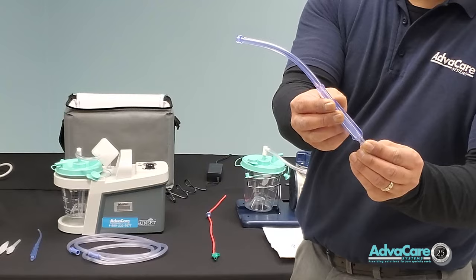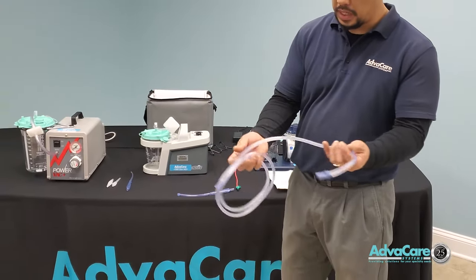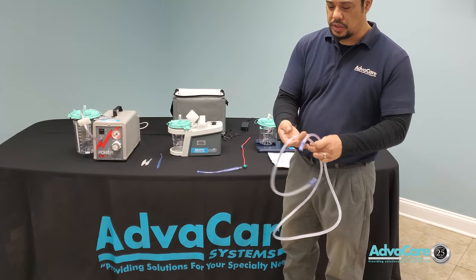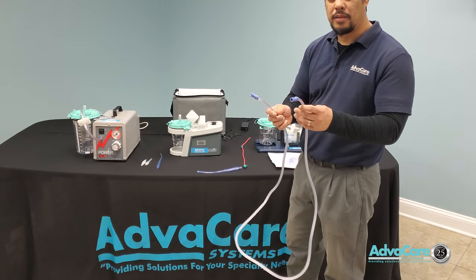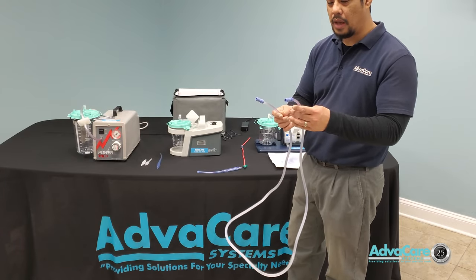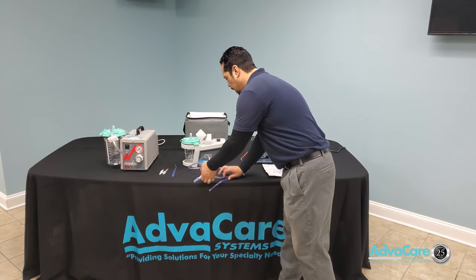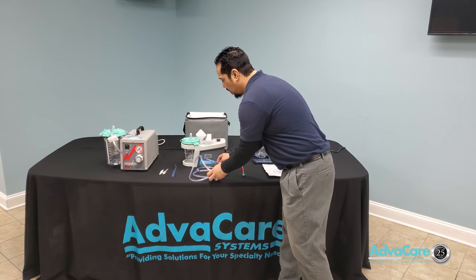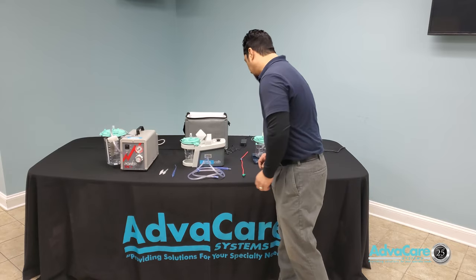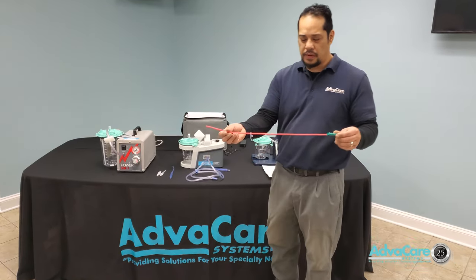The suction tubing here is a universal suction tubing that can be used with different types of suction accessories when applied to the patient. Every basic suctioning will require some type of suction tubing and Yankauer. Other suctioning such as gastric suctioning or upper respiratory suction may require the use of a catheter.